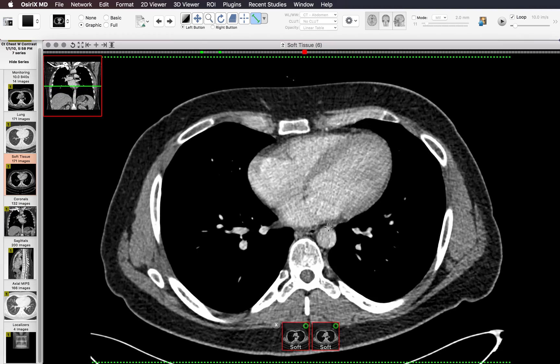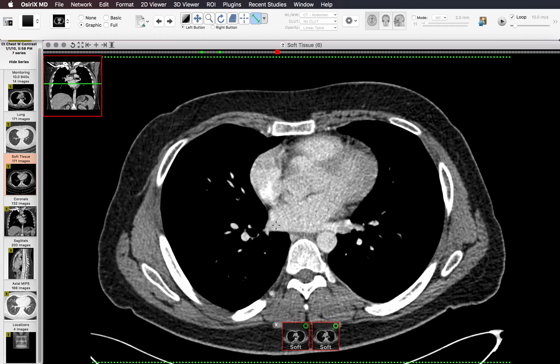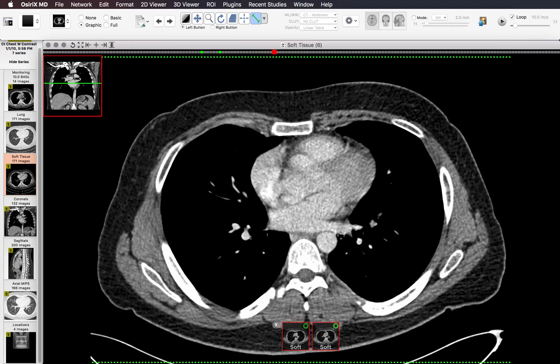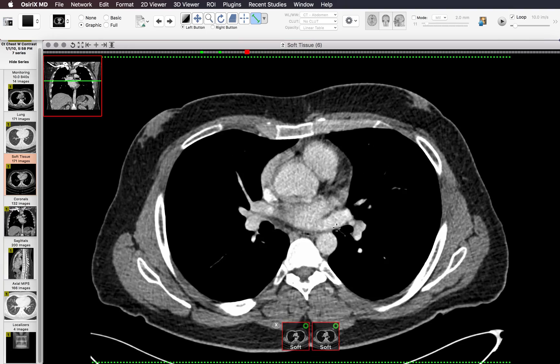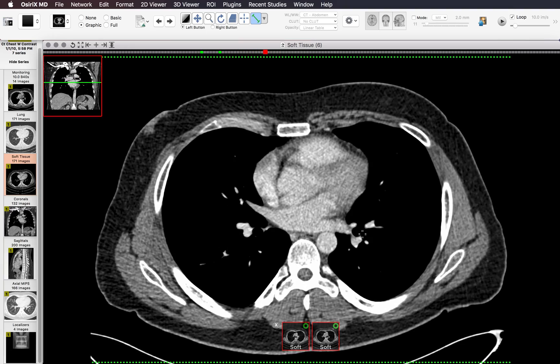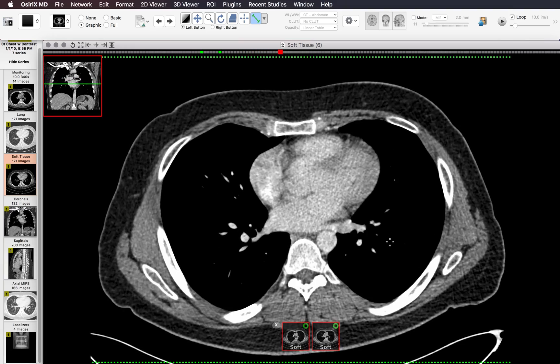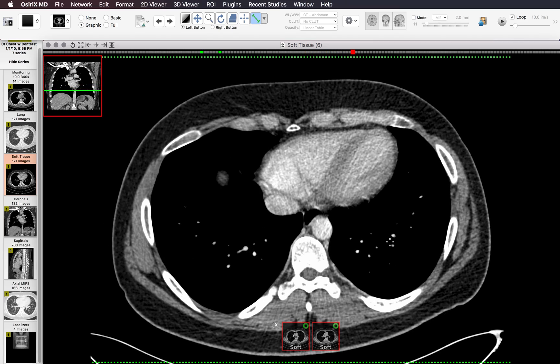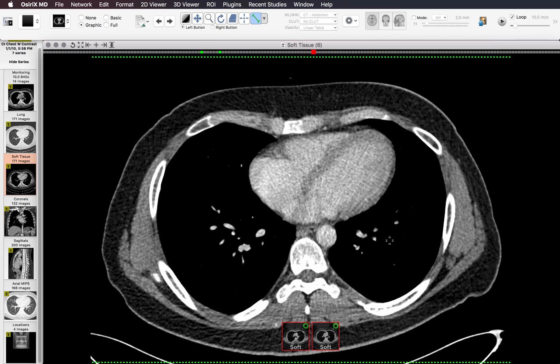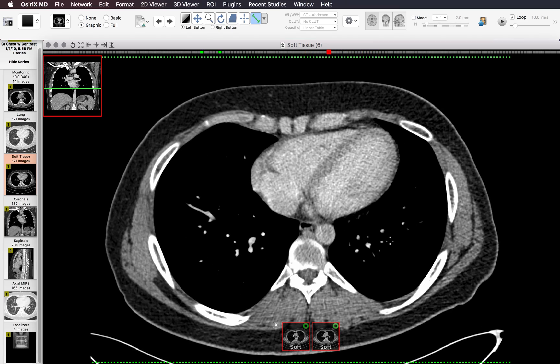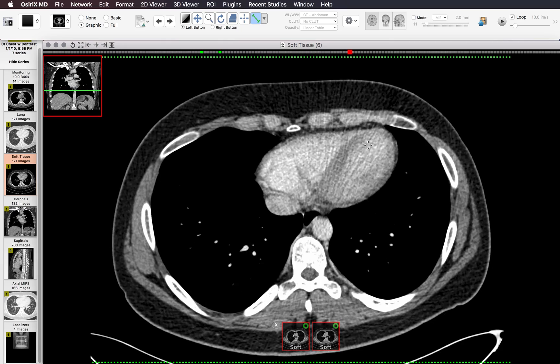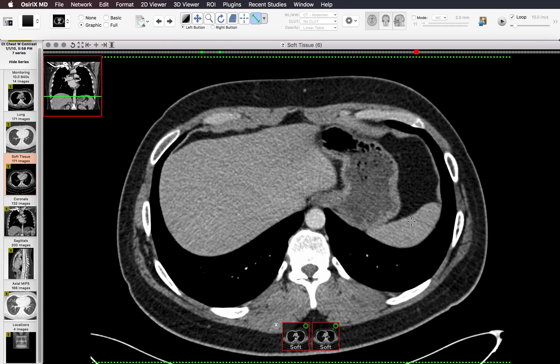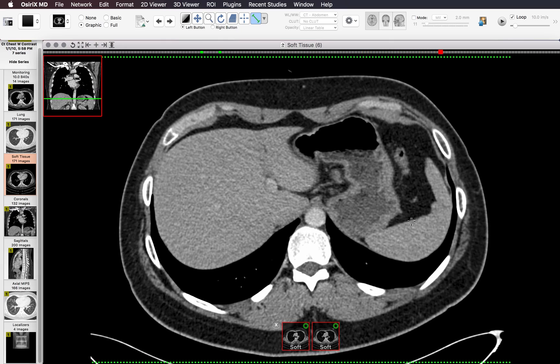While looking at the left atrium, I'm also looking at the four pulmonary veins, making sure they're not stenosed or occluded, which can occur after pulmonary vein isolation and other procedures. Then I look at the pericardium to make sure there's no effusion, pericardial thickening, or calcification.